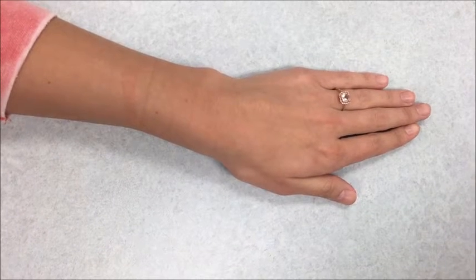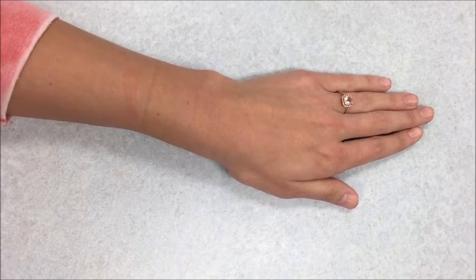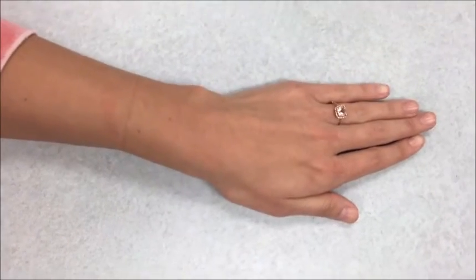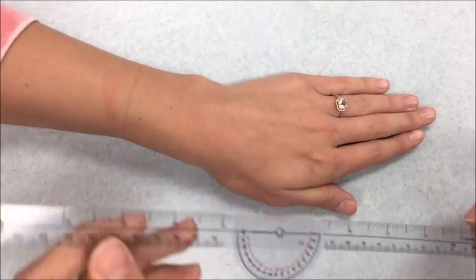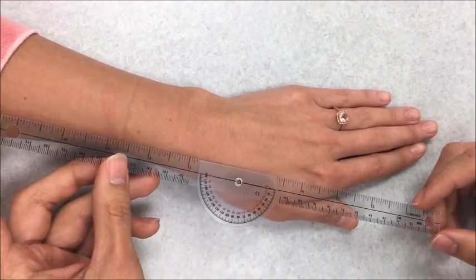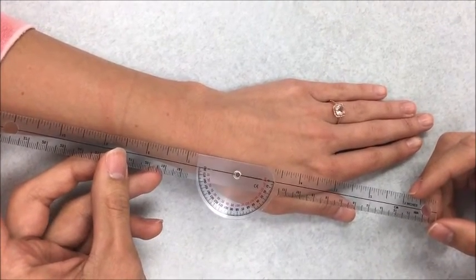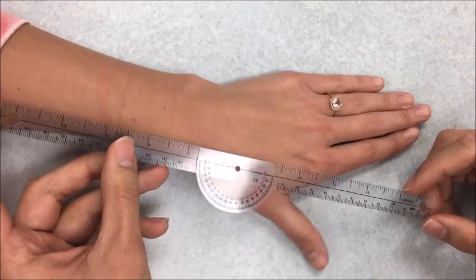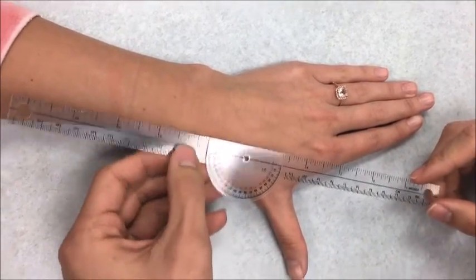Patient is seated with the forearm pronated and the hand palm down, resting flat on a firm surface. The axis of the goniometer is over the carpometacarpal joint at the base of the thumb metacarpal. The stationary bar and the movable bar are both parallel to the radius. The therapist will ask the patient to extend the thumb and follow the thumb with the movable bar.